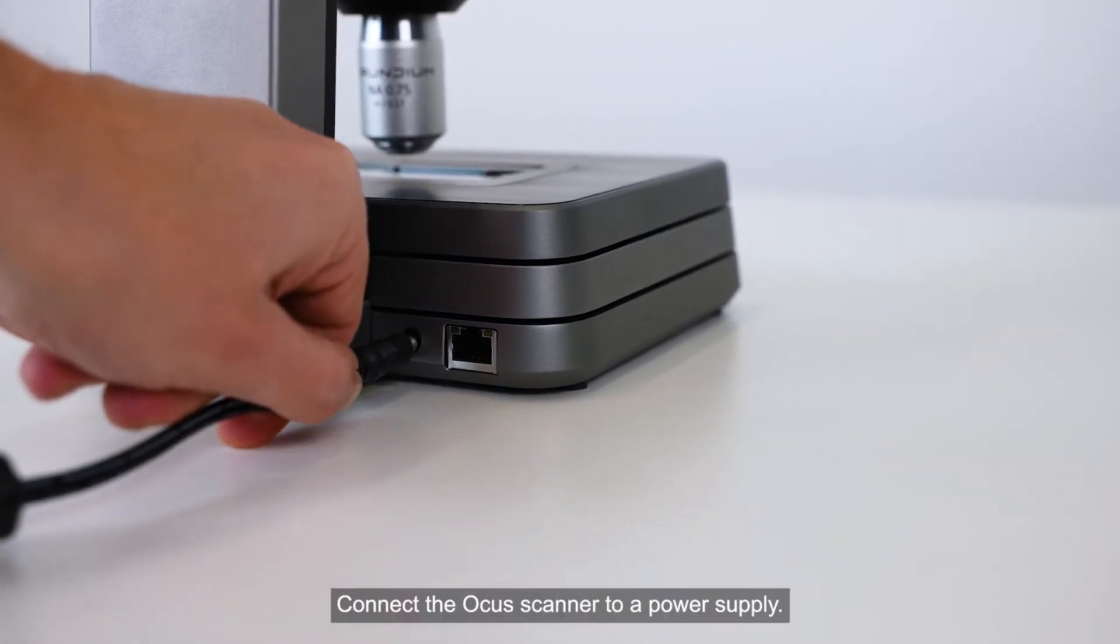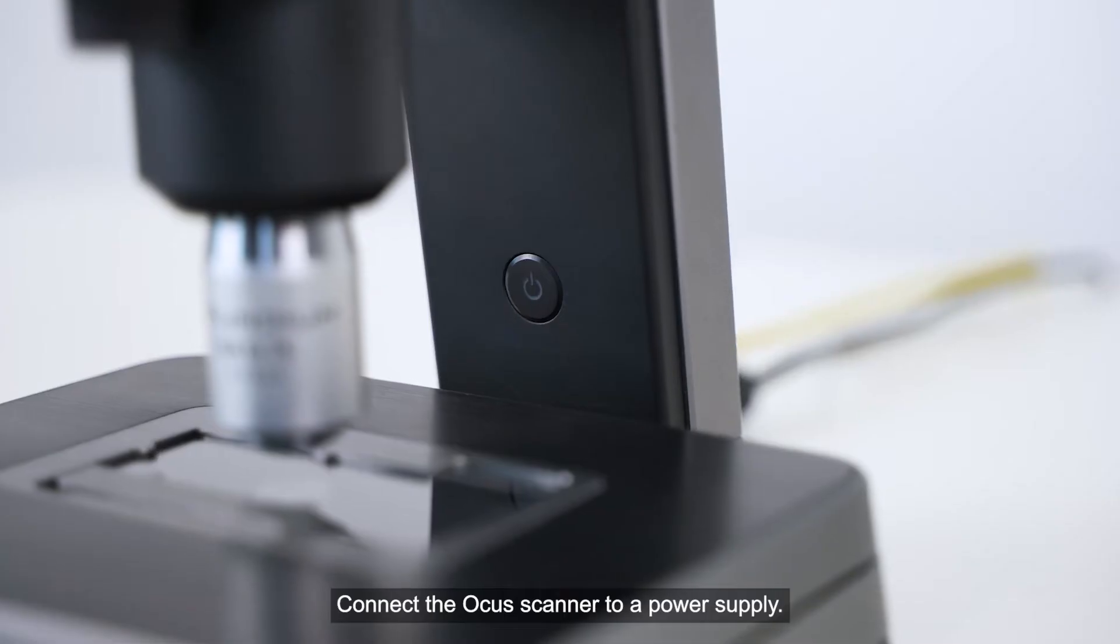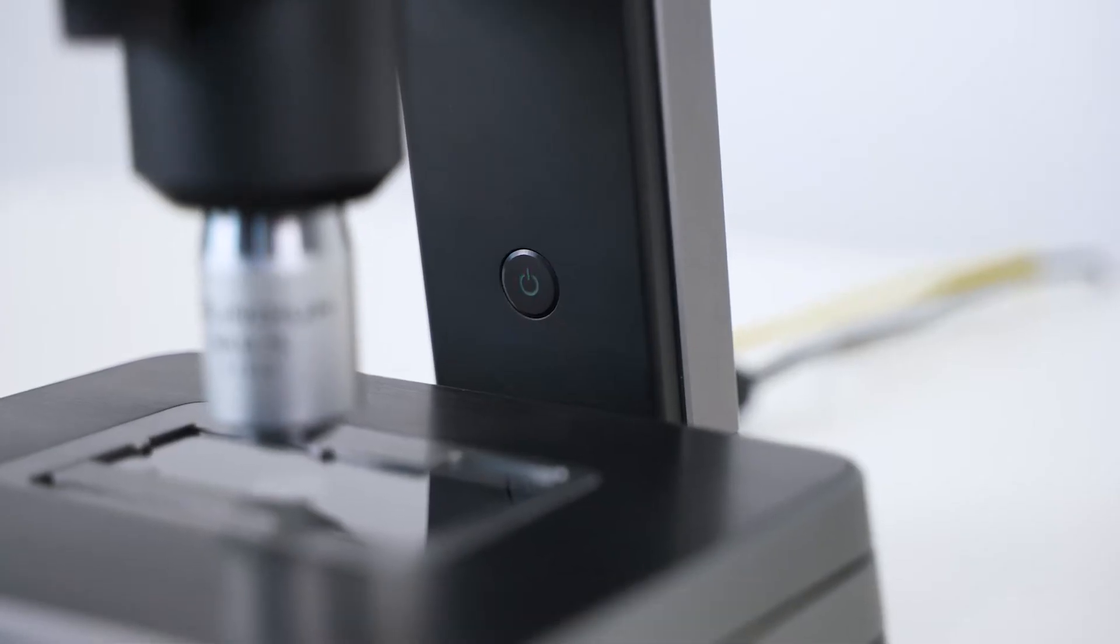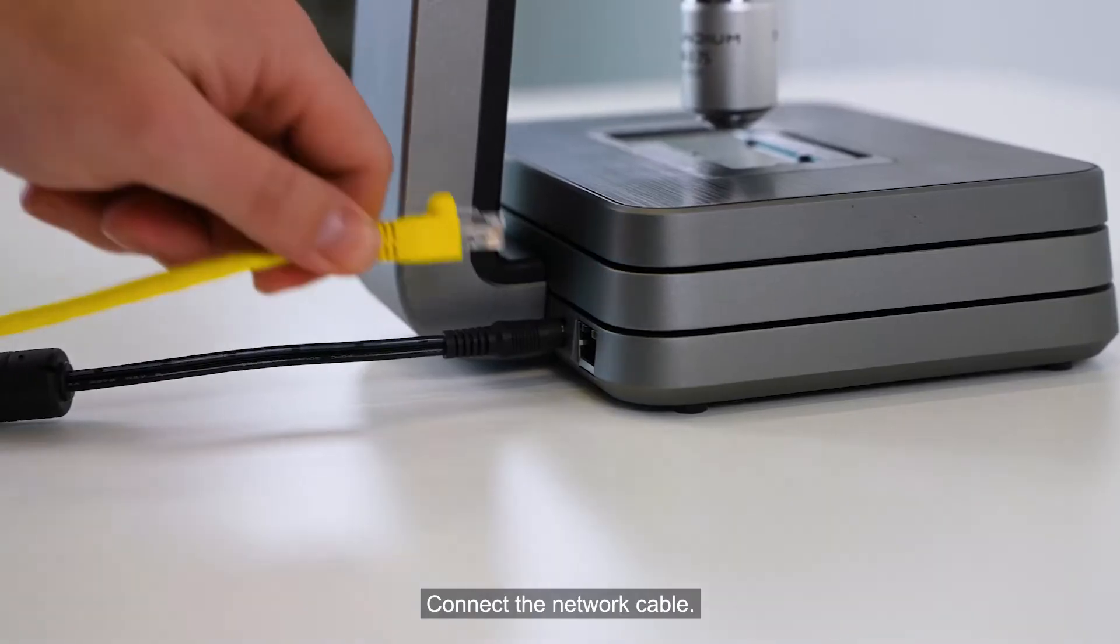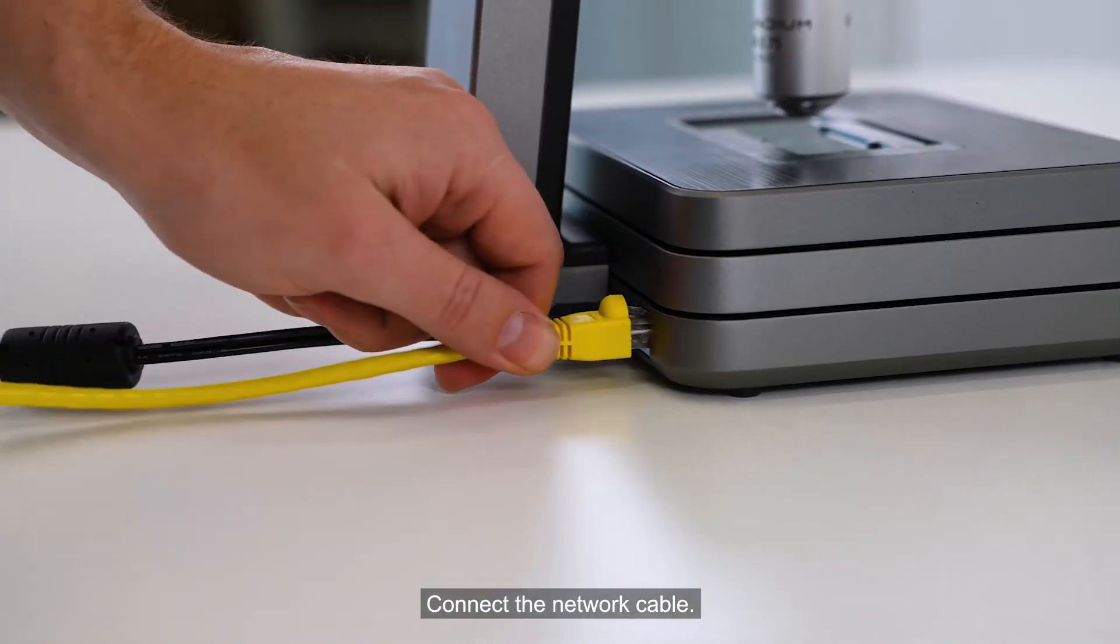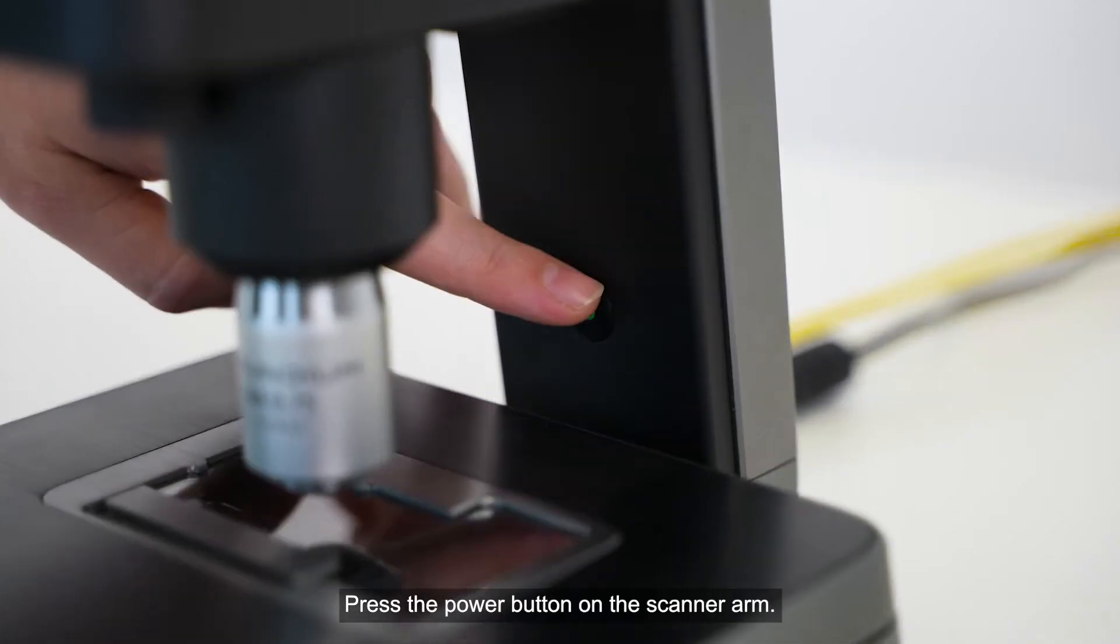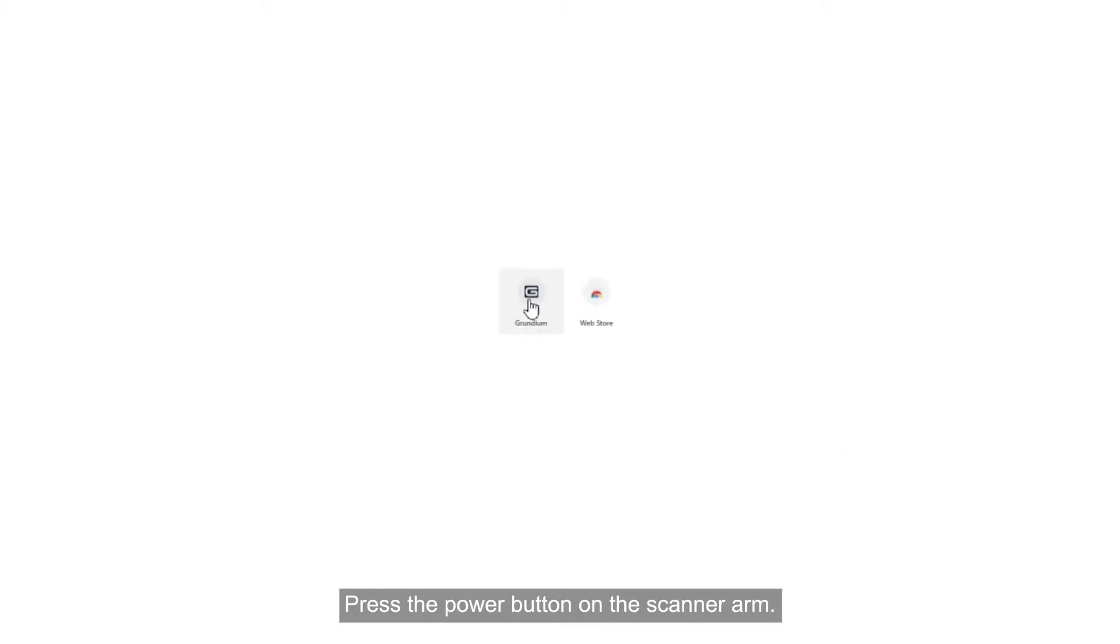Connect the Ocus scanner to a power supply. Connect the network cable. Press the power button on the scanner arm.